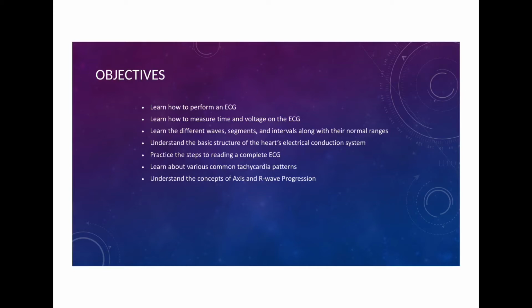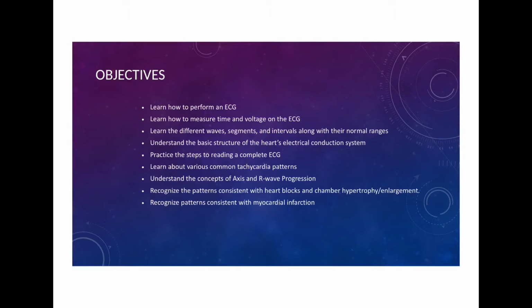to understand the concepts of axis and R-wave progression, to recognize the patterns consistent with heart blocks and chamber hypertrophy or enlargement, to recognize patterns consistent with a myocardial infarction or MI, to interpret the QT interval, and to recognize common patterns consistent with severe hyperkalemia and a pulmonary embolism.